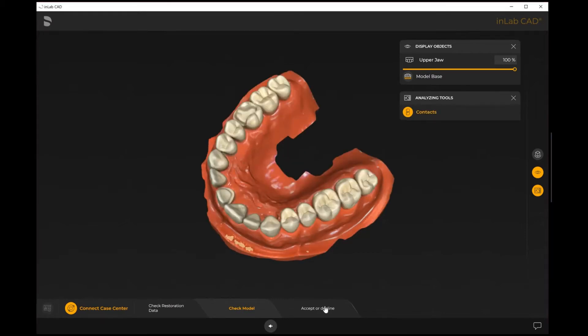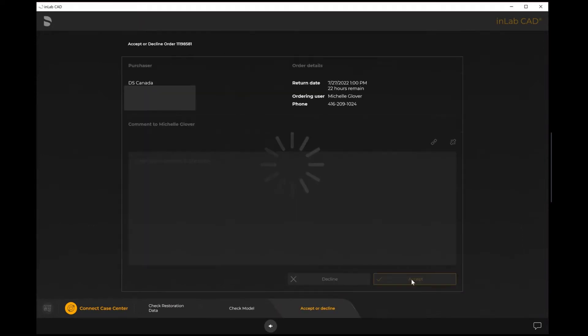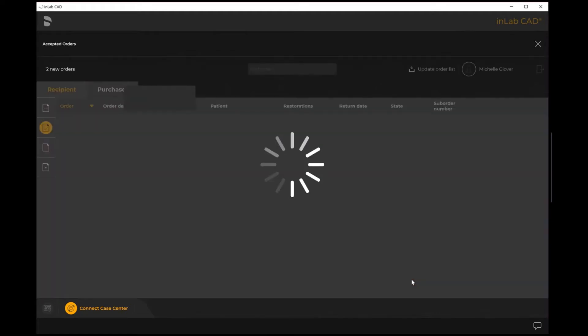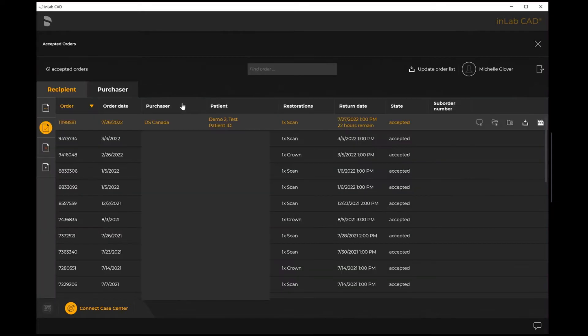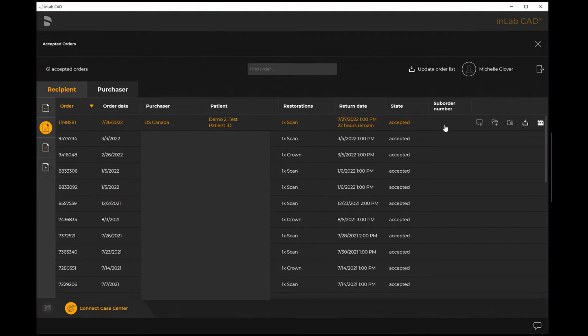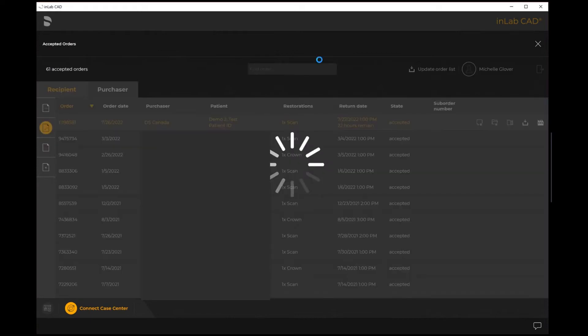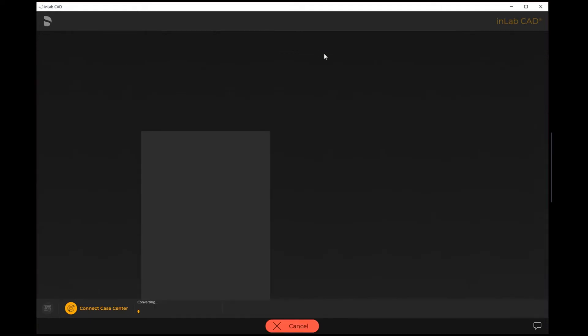The final step is where I want to accept or decline the case. If I'm ready to accept, I just select the accept option here and then I'm able to now download into the inLab system directly. You'll now see the additional option opened up after show work ticket which is download and open case. When I select that option, it's going to download that file directly into inLab.